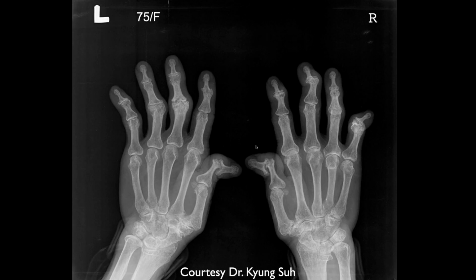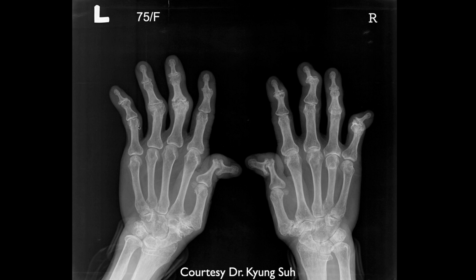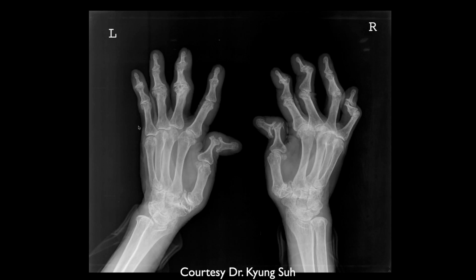Okay. No, we missed a couple, affecting pretty much the whole hand. It's a 75-year-old female. So we have kind of multiple areas of destructive degenerative change, most prominently involving both bilateral first digit IP joints, the third and fourth PIP joints, kind of bilaterally. It's multiple deformities. Base of the thumb. Yeah, and this first CMC joint, well, it's kind of mild.